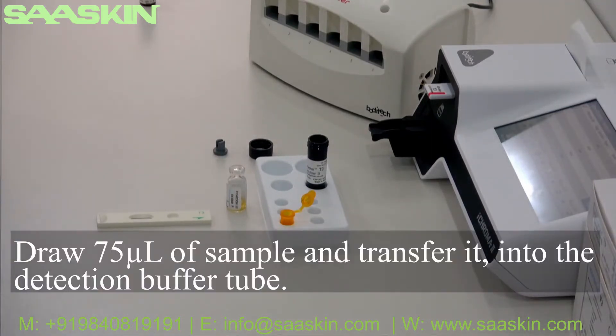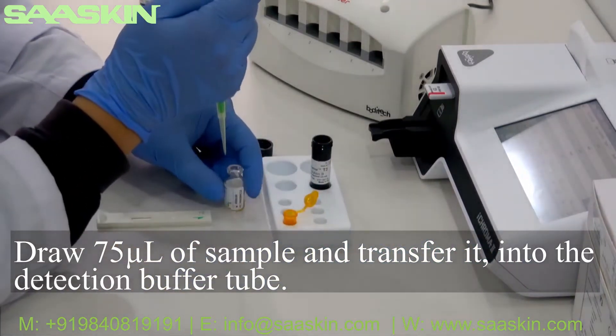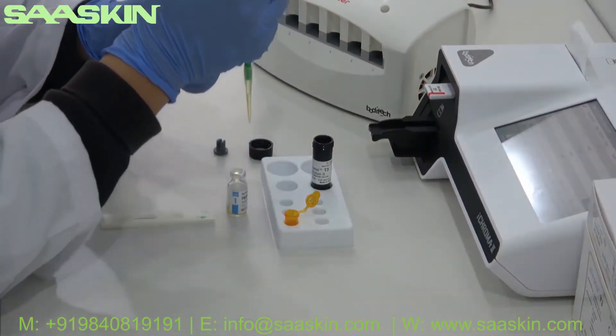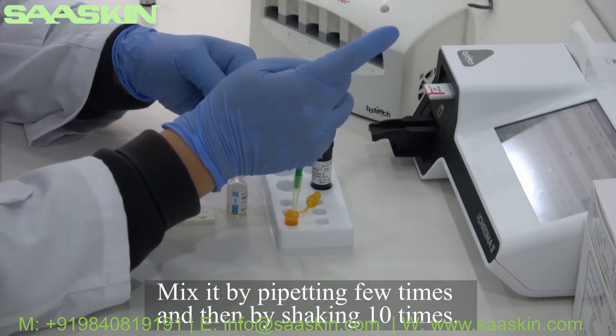Draw 75 microliters of sample and transfer it into the detection buffer tube. Mix it by pipetting a few times and then by shaking 10 times.